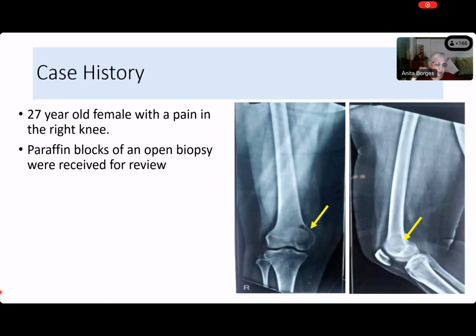No, you cannot talk about encapsulation in a bone tumor or a bone lesion, Prayas. It has a narrow zone of transition. Yes, that's what I meant to say. So it has a narrow zone of transition. You see that you can mentally put your finger around it to mark the demarcation of this lesion. Okay. So now, what is your diagnosis, Prayas, on this?